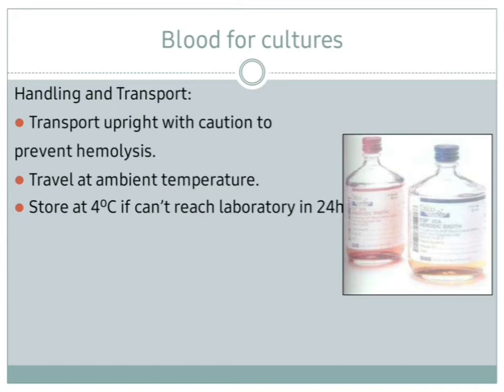Also, you have to travel at ambient temperature, the environment temperature, and if the sample cannot reach laboratory in 24 hours, then we have to store it at 4 degrees centigrade in order to preserve the specimen.